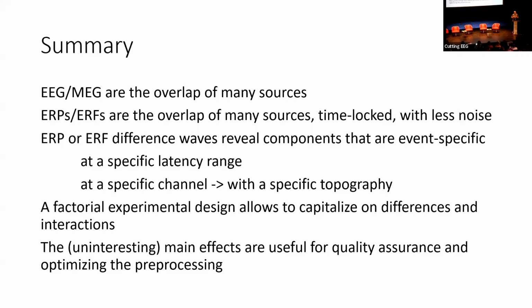If you then consider what you were just asking, that the ERP is the same over trials but just varies in amplitude, then you can also see that by subtracting the ERP from each individual trial, you're not totally removing the ERP. So by subtracting the ERP from individual trials prior to time frequency analysis, you're reducing the effect of the ERP, but you're not totally removing it. Which is also why I typically don't bother with it, because if it's still in there, I just have to explain it.